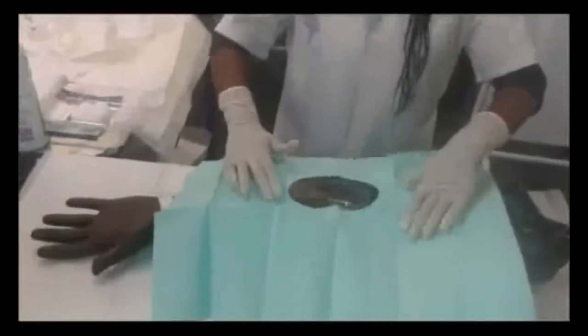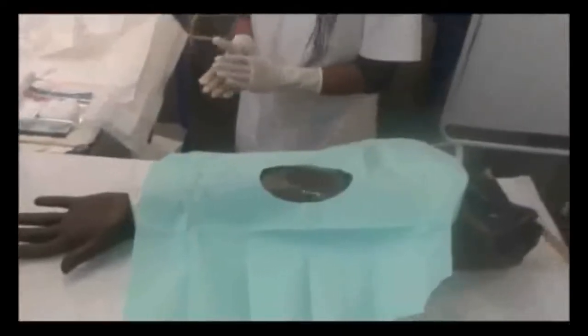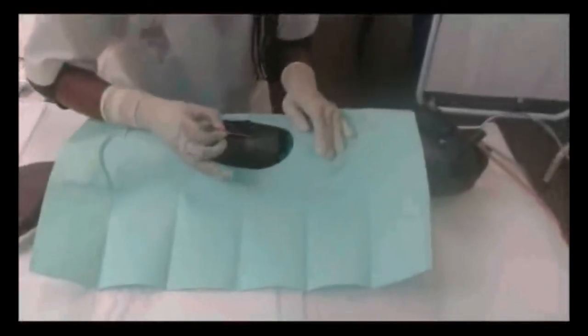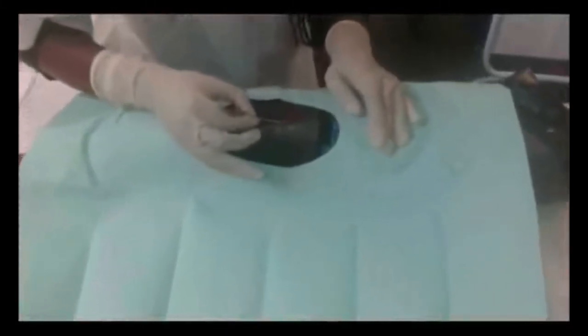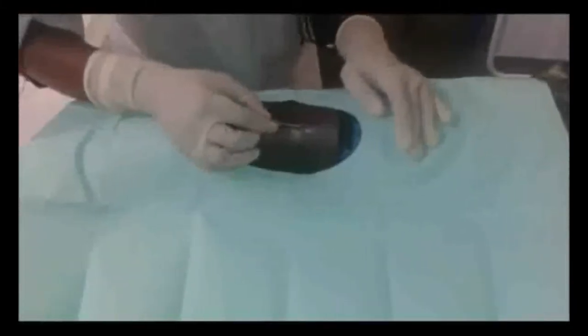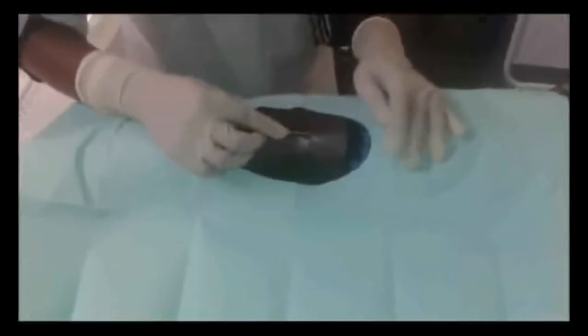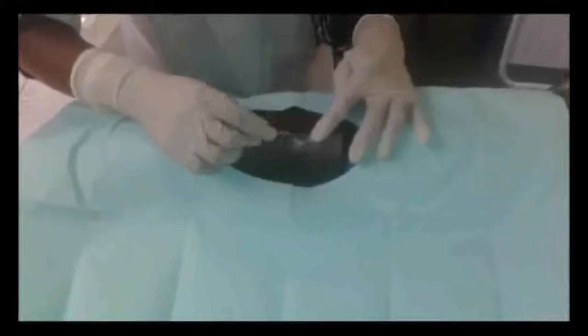Next, get your cannula ready. Make sure that your cannula is actually loose from the needle. You want to insert the needle at an angle of 25 to 35 degrees to the skin. When you are inside the vein, you should see a flashback of blood in the cannula. That will confirm that you are in the vein. Now try to advance your cannula sheath into the vein. Make sure you put pressure on the vein in order to secure the cannula and also to minimize any bleeding.